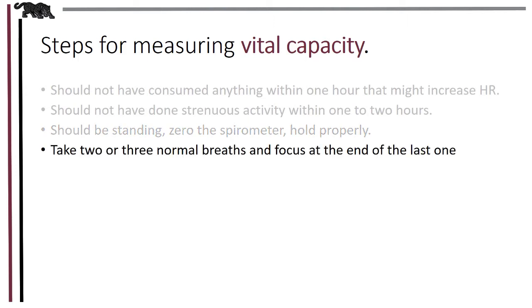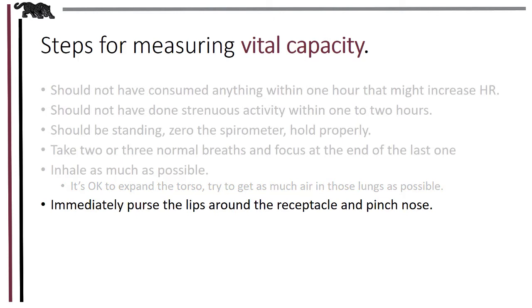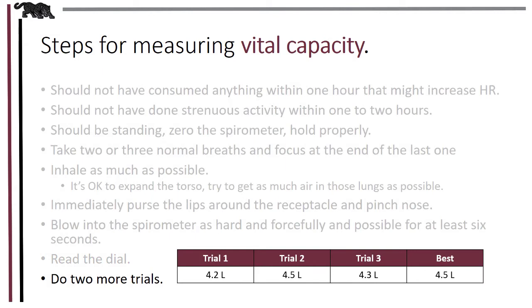After a normal breath, you do a nice, smooth, continuous exhalation until complete. And then you inhale as much as possible, and you really try to fill those lungs with air. Then immediately you purse your lips firmly around the receptacle, and the nose is pinched shut. And then you exhale rapidly and forcefully for a minimum of 6 seconds. Then you read the dial and record it. You do that 2 more times, and you take the best of the 3 trials.